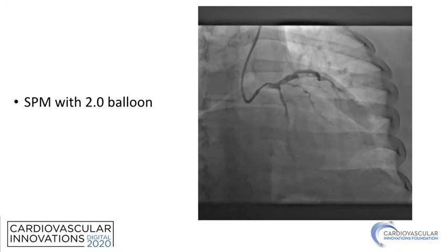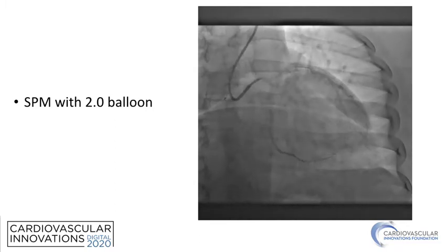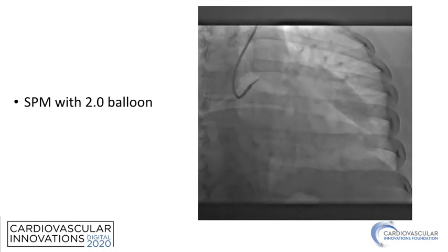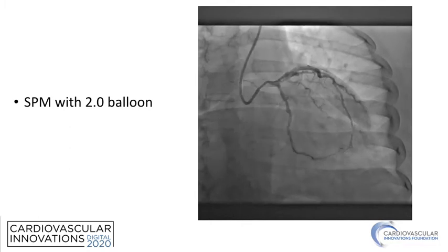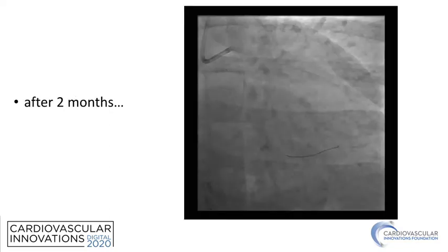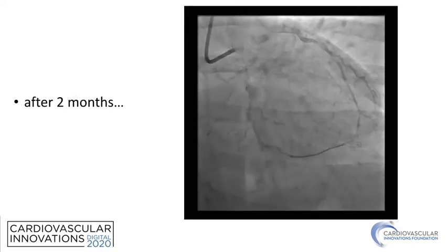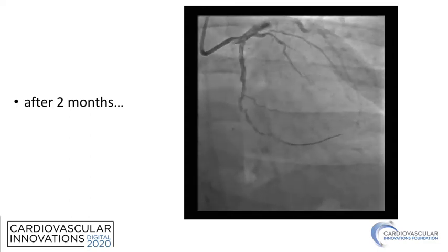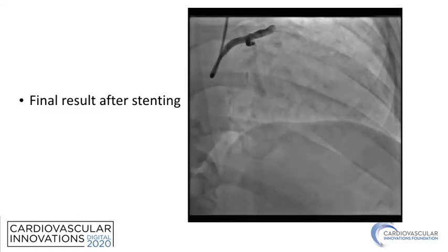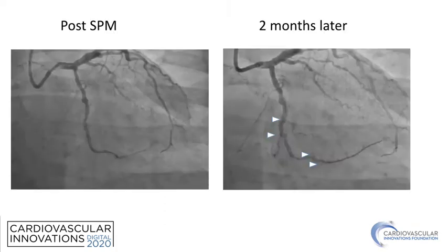Following that, the vessel is dilated and there is distal flow. However, note the absence of many side branches. Stenting at this point is not advised, so the decision was made to bring the patient back two months later. At that point, the dissection planes are somewhat healed and many side branches are visible. The vessel was stented with a good final result — highlighting the difference between immediately post-SPAM and two months later, with recruitment of side branches at follow-up.